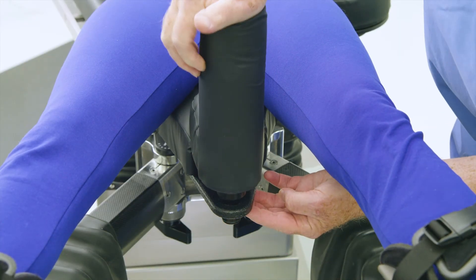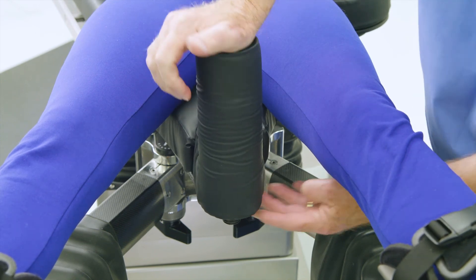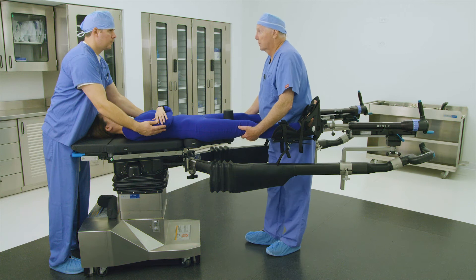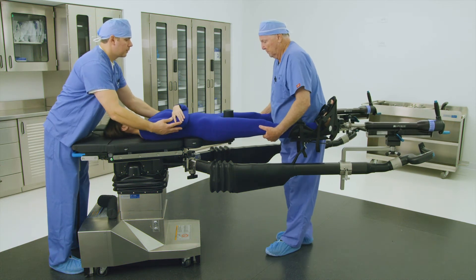Ensure the post is fully seated into the sacral rest's hole. Failure to ensure correct placement could result in patient injury during active traction. Finally, shift the patient snug against the perineal post and ensure there is no space between the patient's perineum and the perineal post.